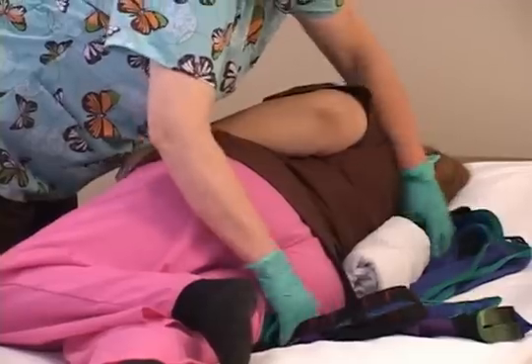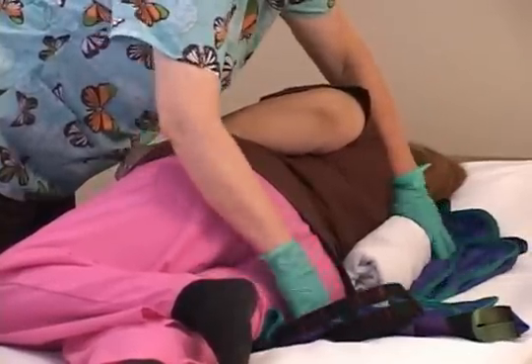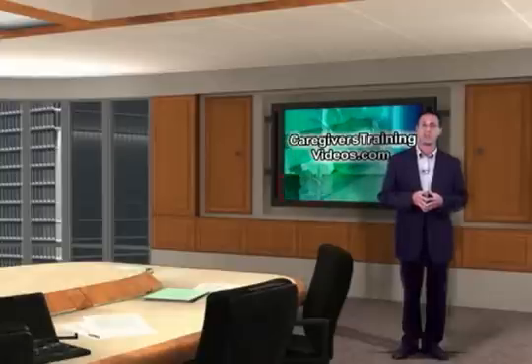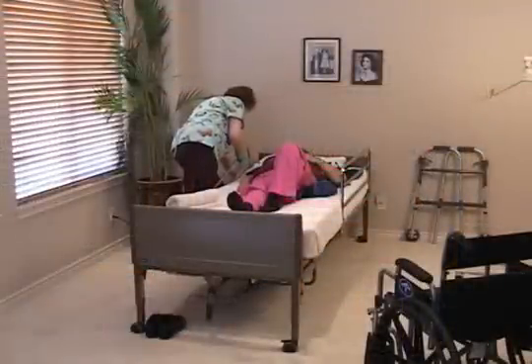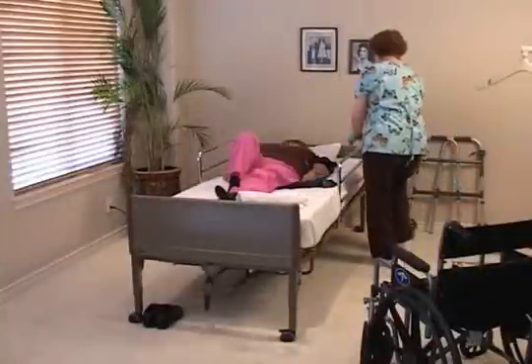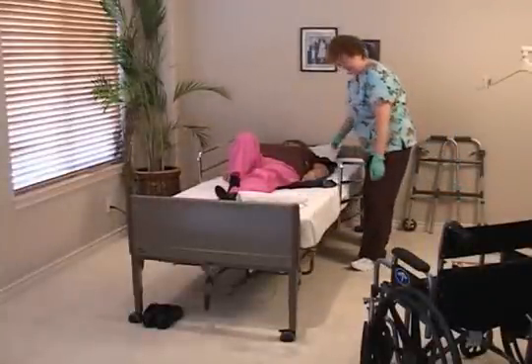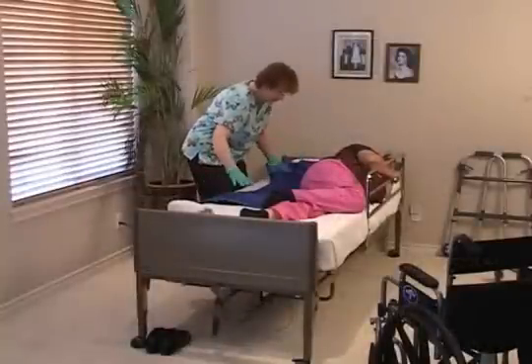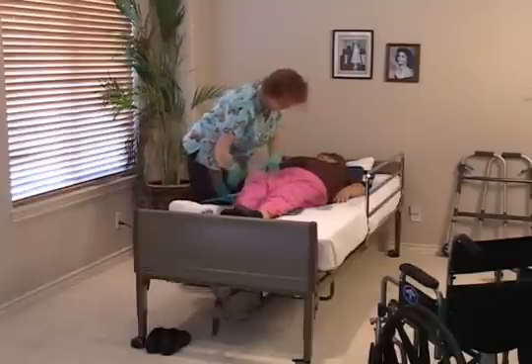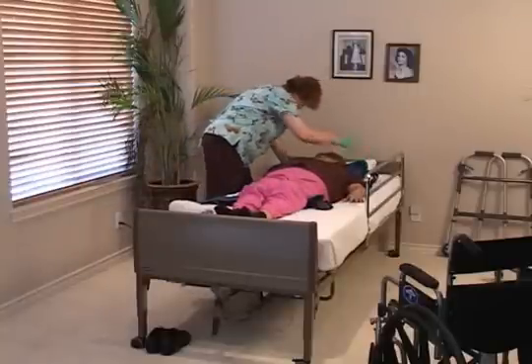11th, then place the sling under the resident. 12th, remove the wedge and roll the resident back to the supine position. 13th, also raise the bed rail. 14th, you should position yourself on the transfer side of the bed and lower the bed rail. 15th, and repeat the process. 16th, lift the bed rail.